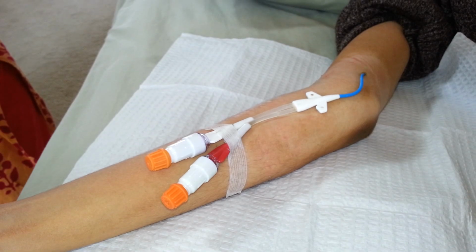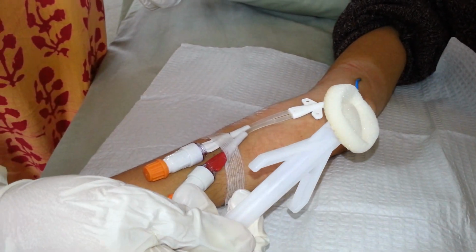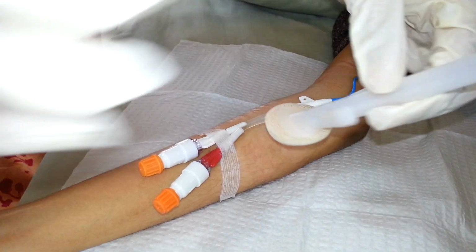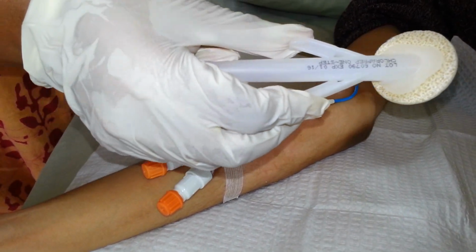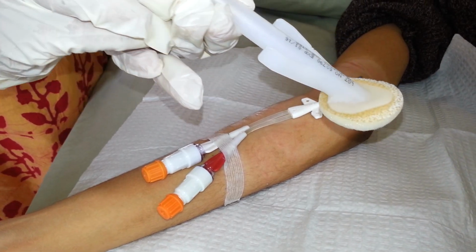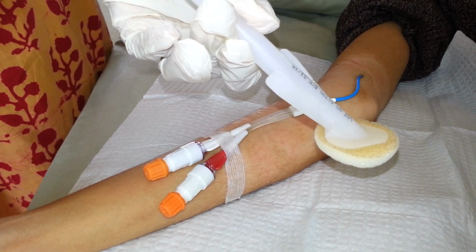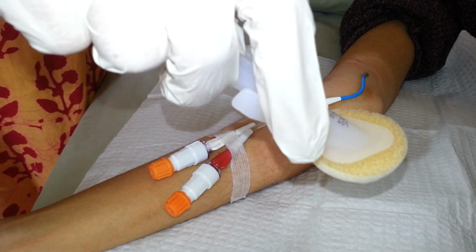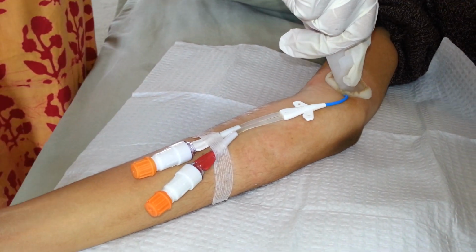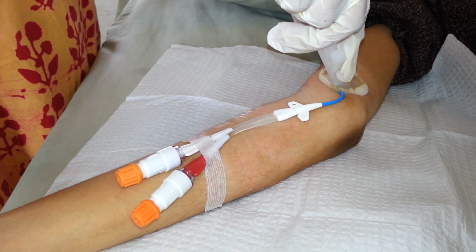Now that we have cleaned this site with alcohol, we will now clean it with chlorhexidine, which is a very powerful antimicrobial agent. This is the ChloroPrep stick. When we break the stick by pressing on the edges with inward pressure, the chlorhexidine inside flows into the sponge at the bottom. Hold it for a few seconds while the entire contents go into the sponge. Then we place the sponge over the insertion point for a few seconds so that the chlorohex can seep into the insertion point and kill any germs in that area.